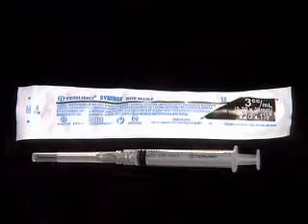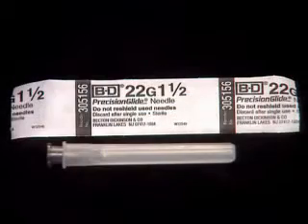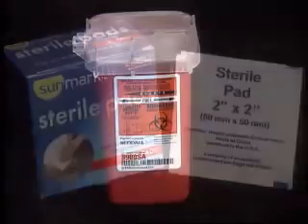You will also need a Q-cap, 3 cc syringe, half-inch needle for subcutaneous injection or one-and-a-half-inch needle for intramuscular injection, alcohol wipes, sterile gauze pads, and a sharps container.